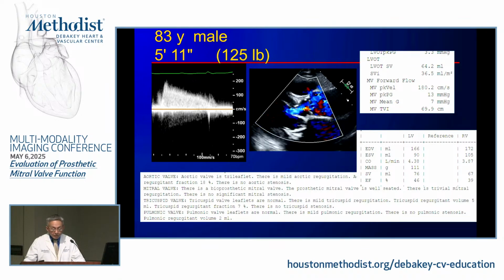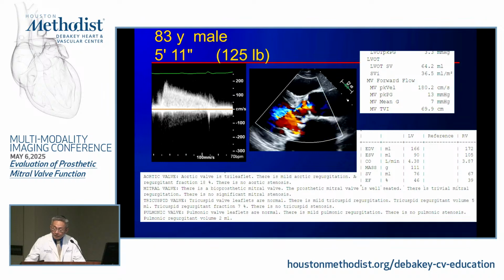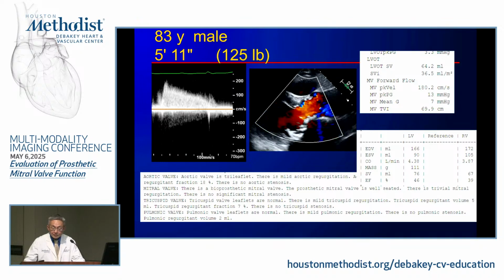right? So the patient had MRI done before TEE. So what do you think? Should the patient have gone through a TEE or MRI? Well, I don't think anybody has. Yeah, go ahead.